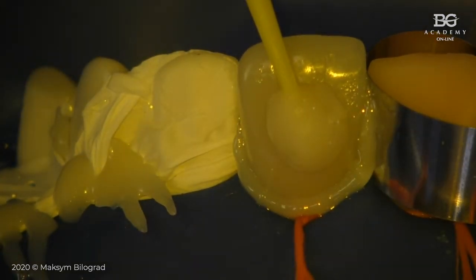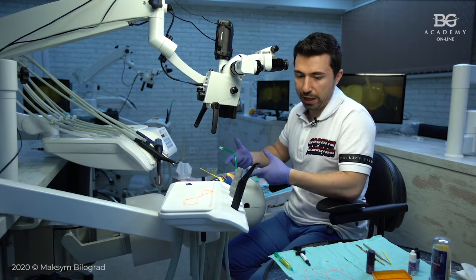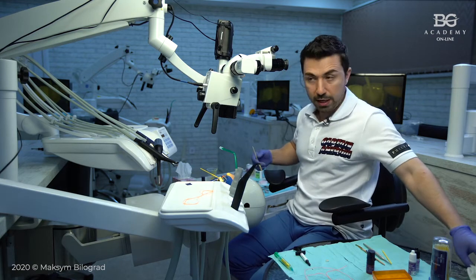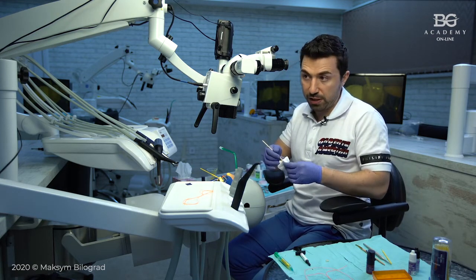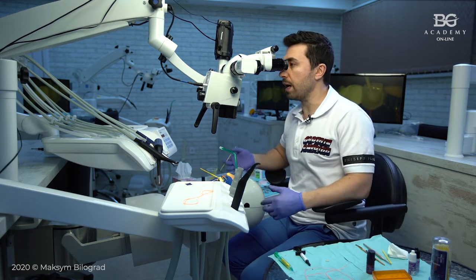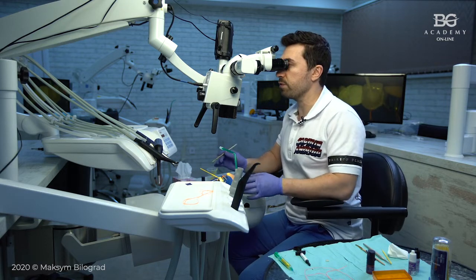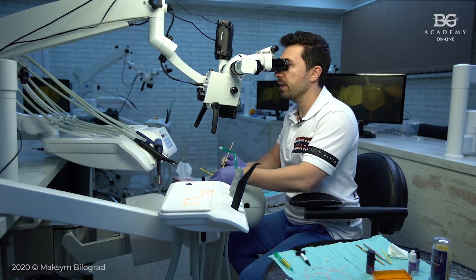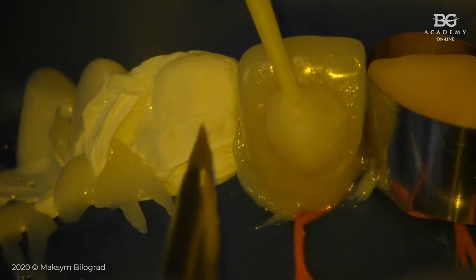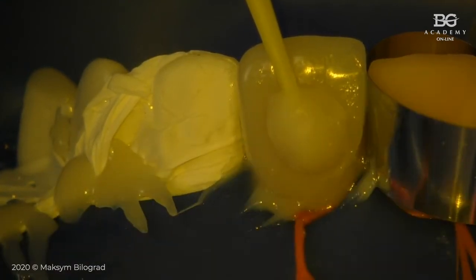There is one of the methods to cement veneers. When you just put your veneer like this, some people say that you can pre-cure, like 1 second pre-curing, and then you take a probe or explorer and remove this pre-cured resin in a really fast way. Personally, I'm not a big fan of this approach. I love to work a little bit differently. I just take a brush and start to remove the major excess of material with the brush. And in this case, I will explain the cement that I like to work with.